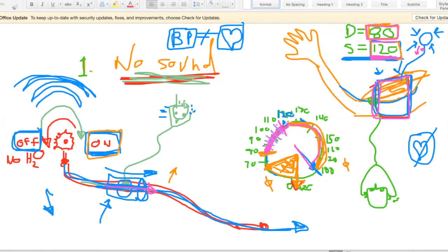And what you're hearing in this range, the beats that you're hearing in this range, is not the actual beats of the heart, it's the change in pressure compared to the vessel, the brachial artery, and the sphygmomanometer. And when the blood is able to squirt through the sphygmomanometer, you'll hear something. And then when it's no longer able to, you won't hear anything.